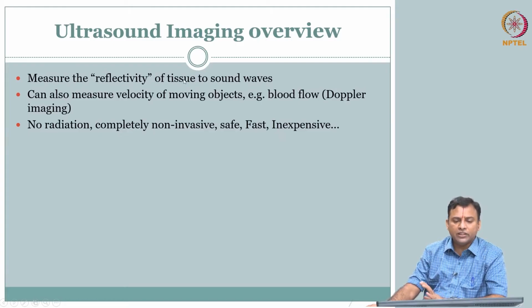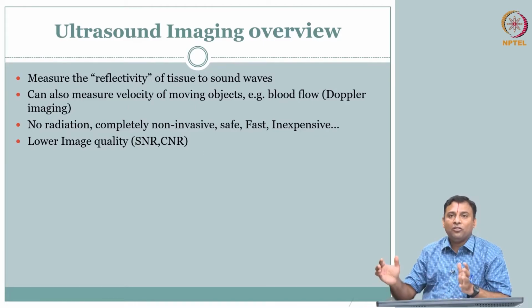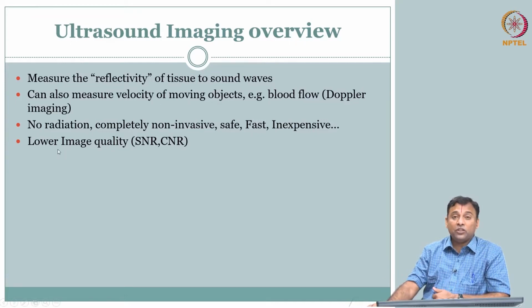So, it has a lot of advantages, it gives you new information. But if this could do everything, there would be no need for the other modalities. Like I told you, in this whole field there is always a give and take, a trade-off. If you look at the image quality, in terms of signal to noise ratio or contrast to noise ratio, it is typically much smaller compared to the radiation imaging that we covered so far. Of course, it is also much lower than the beautiful modality that we will cover later, which is MRI.